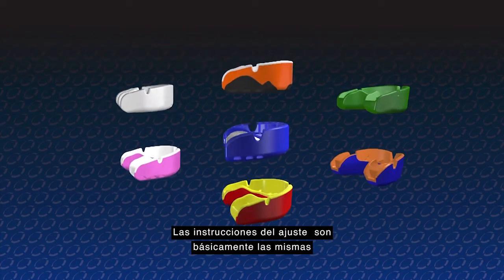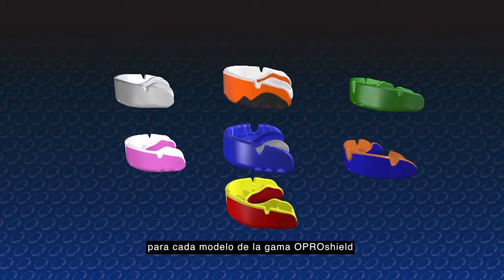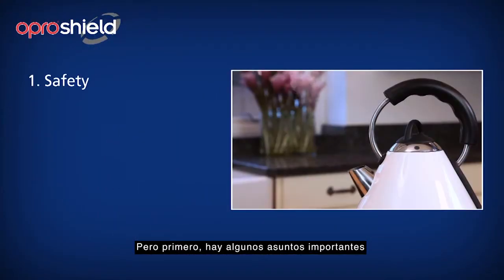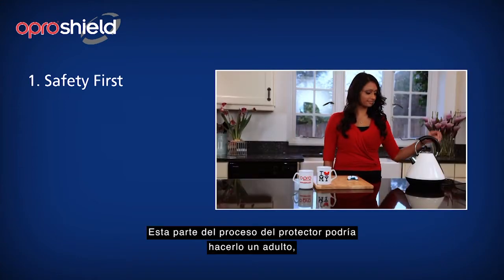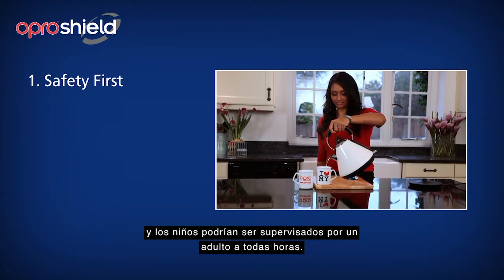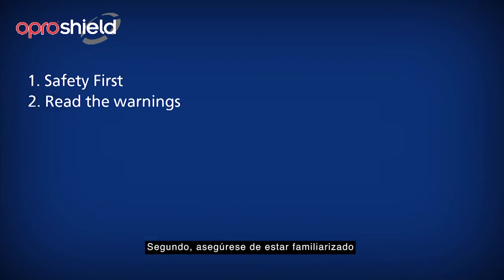The fitting instructions are fundamentally the same for every model in the OproShield range, but firstly, there are a few important matters. Fitting your OproShield requires the use of boiling water. This part of the fitting process should be done by an adult, and children should be supervised by an adult at all times. Secondly, please be sure you are familiar with all the warnings printed on the written instructions.